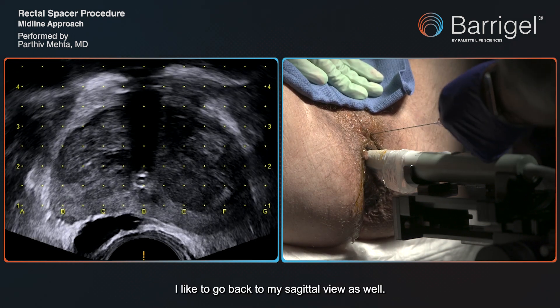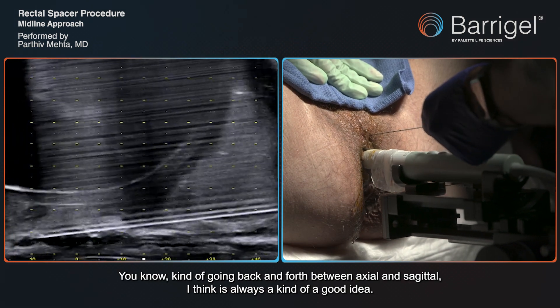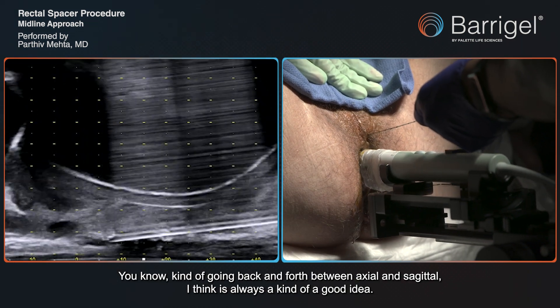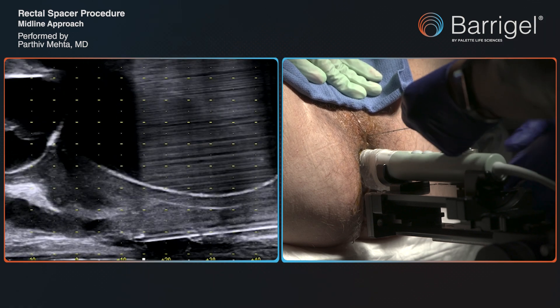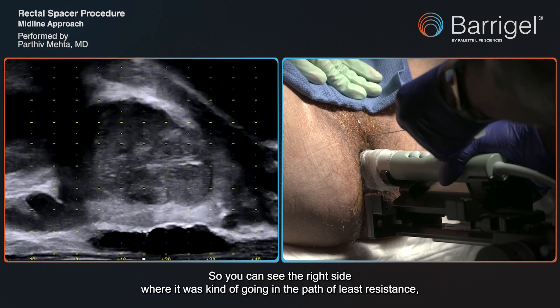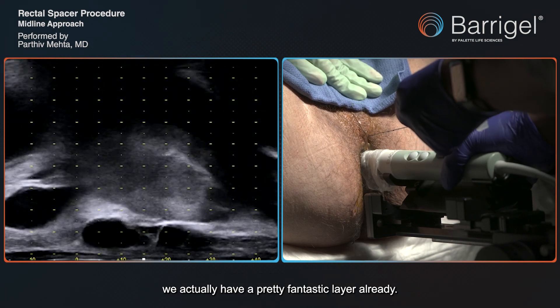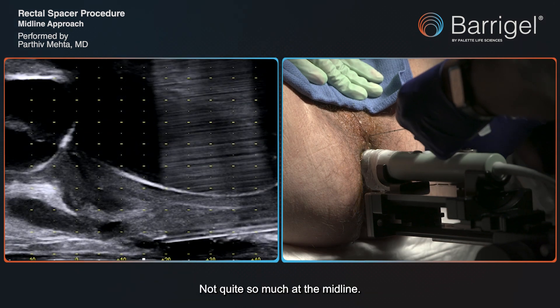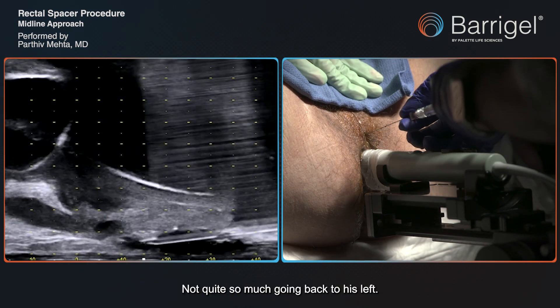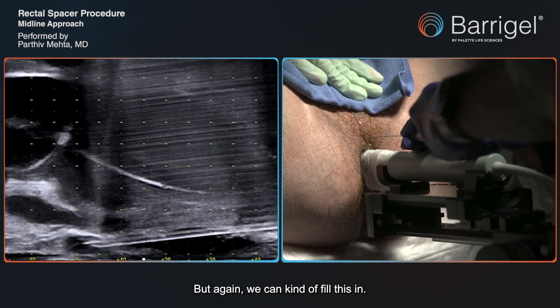I like to go back to my sagittal view as well. Going back and forth between axial and sagittal is always a good idea. You can see the right side where it was going in the path of least resistance — we actually have a pretty fantastic layer already. Not quite so much at the midline, not quite so much going to his left, but again we can fill this in.